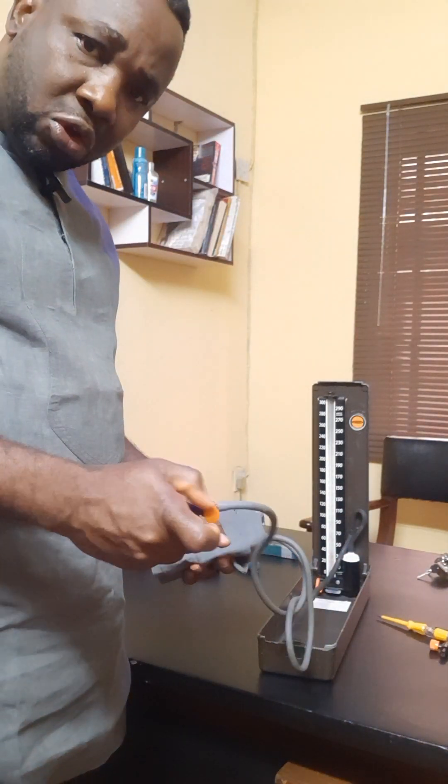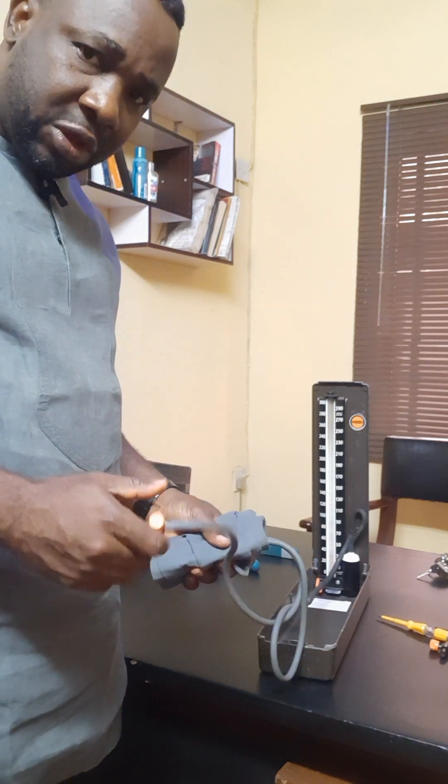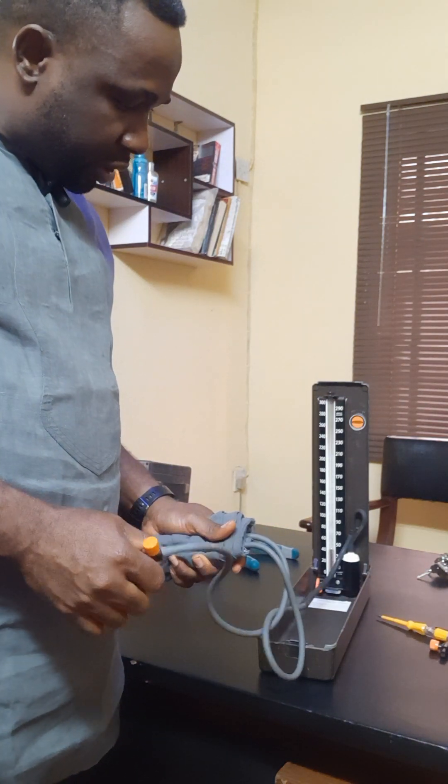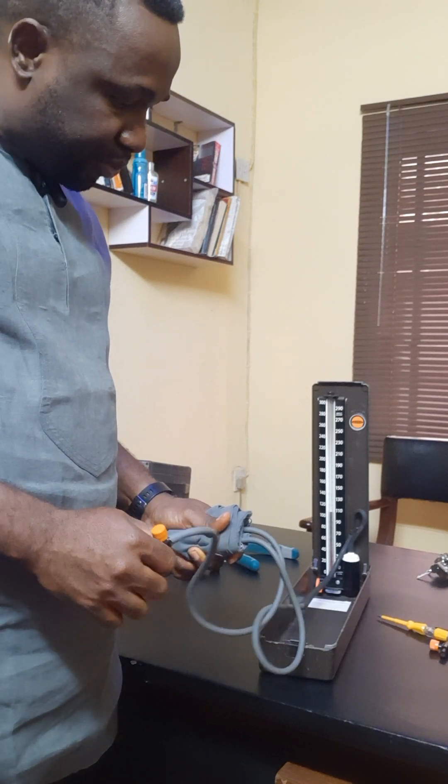This is the opening and locking of this very apparatus. I will pump so that you see how it goes. Can you see that? It doesn't have any pressure.